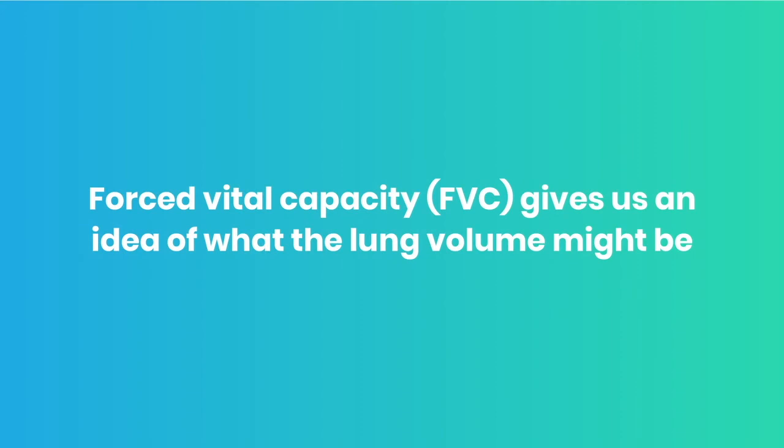So the forced vital capacity gives us a bit of an idea as to lung volume. But the lung volume, of course, includes the residual volume that we're not able to measure. So it doesn't give us an exact measurement of lung volume, but it gives us an idea as to what the lung volume may be.